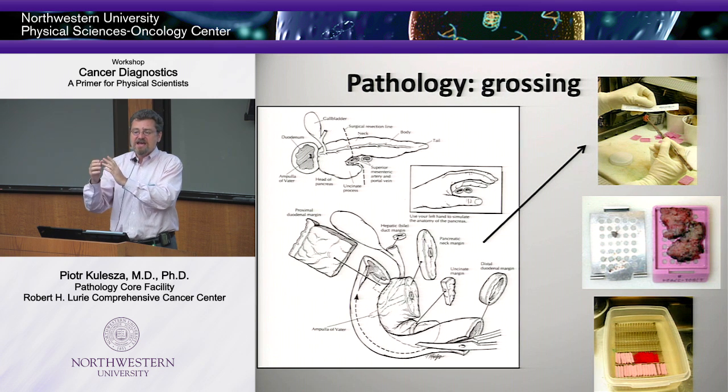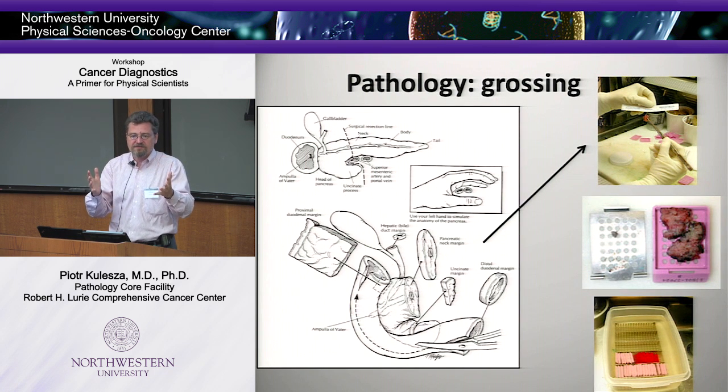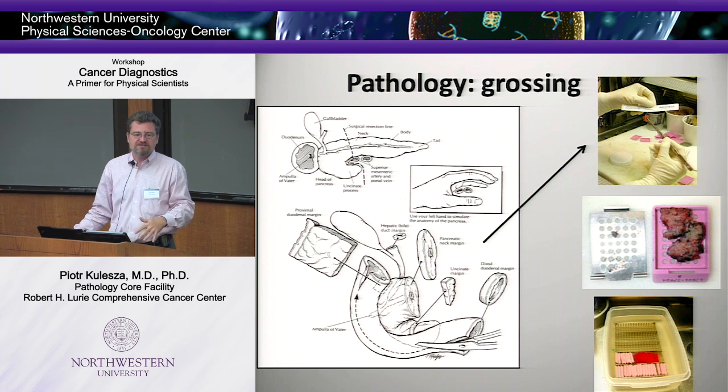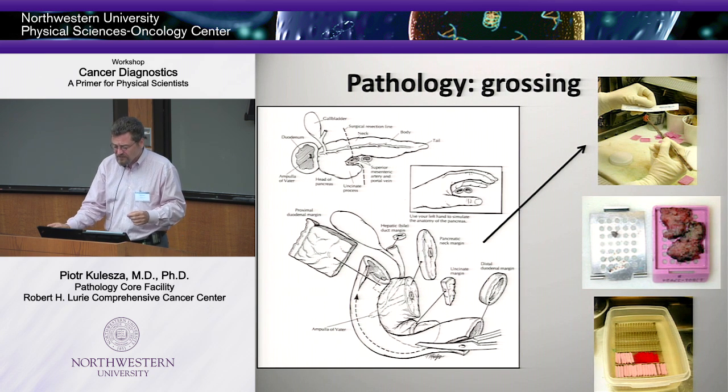at that point. And then if the lesional cells or the structure that's abnormal affects that, then we call it margin positive. That means that the surgeon probably either should have sent us a frozen section to see it in real time, or the patient should undergo a re-resection of that particular lesion. That happens. Sometimes it's very difficult to do this in real time because there are multiple contact points, okay?